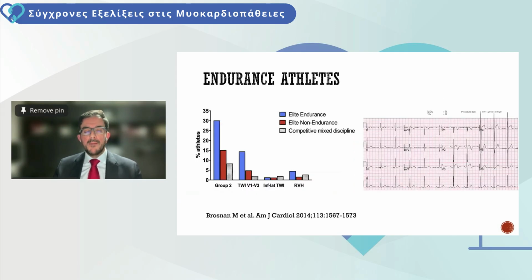Now, why do we worry about lateral T-wave inversions? We worry because they are associated with a cardiomyopathy phenotype. It's quite a common finding in cardiomyopathy, such as hypertrophic cardiomyopathy, but even dilated and arrhythmogenic cardiomyopathy. And they're not usually a feature of athletic adaptation to exercise.